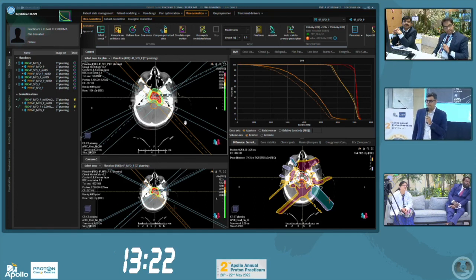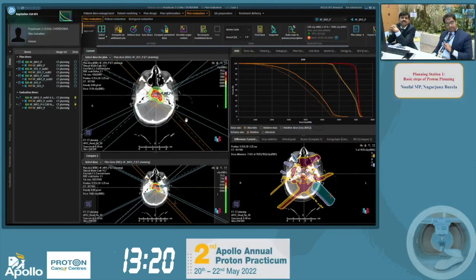Brainstem's density is different. The lesion itself, the cyst part of it is different. The solid part of it is different. There is your shunt in front of it. So many things dynamically changing over time in weeks, so how do you account for this with SFO or MFO or whatever it is? That is precisely the reason why SFO is better.